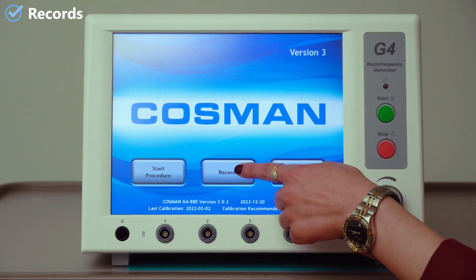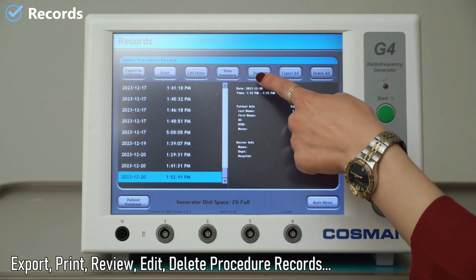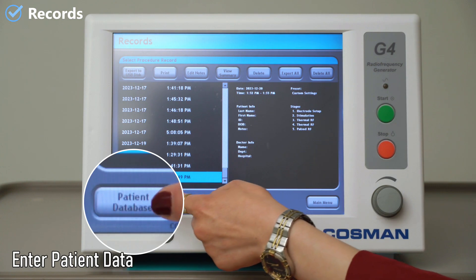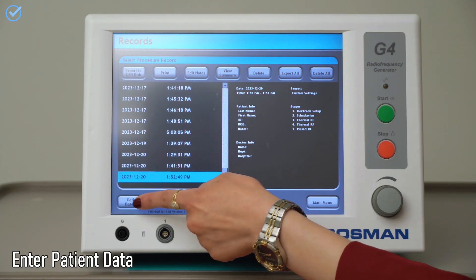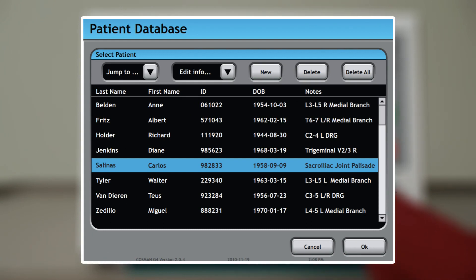By pressing the records button, we can export, print, review, edit, and delete procedure records saved in the generator. Also, we can enter patient data via the patient database button. Patient names, HC number, notes, etc., can be stored.